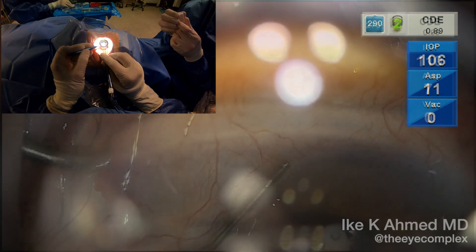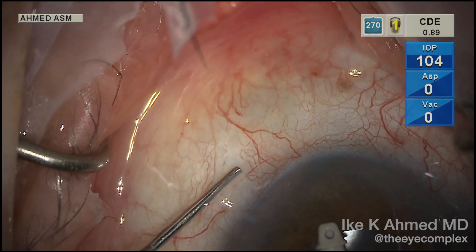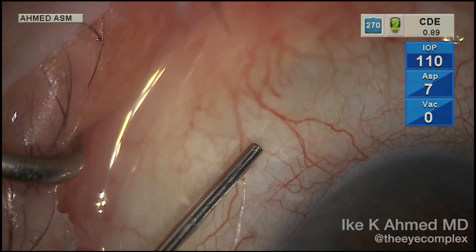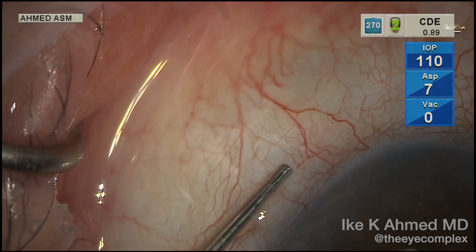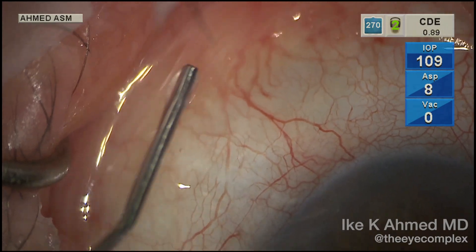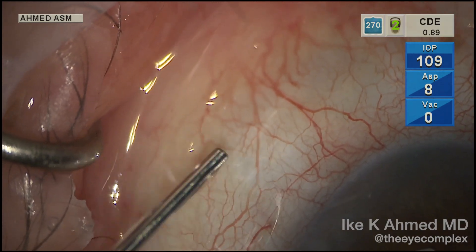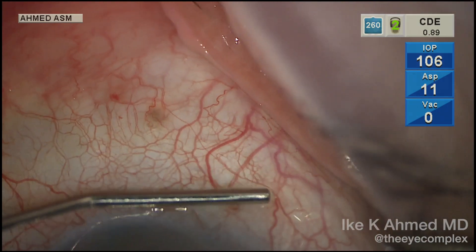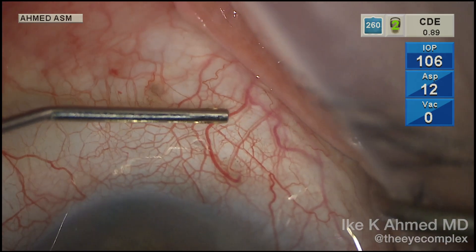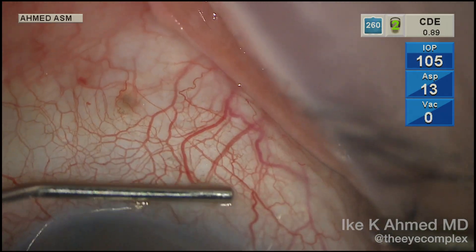Minimal blood reflux here, which is great. As we inject BSS into the anterior chamber with infusion, we nicely demonstrate passage of aqueous into the aqueous veins. We can see the blanching of those episcleral and aqueous veins, in particular in the vicinity of where those ostomies were made. Passage of aqueous is demonstrated here with pressurization of the anterior chamber and some palpation of the sclera, with boxcarring and trilaminar flow present in all the nasal quadrants where the ostomies were performed — evidence on the table that we have achieved increased outflow in those areas.